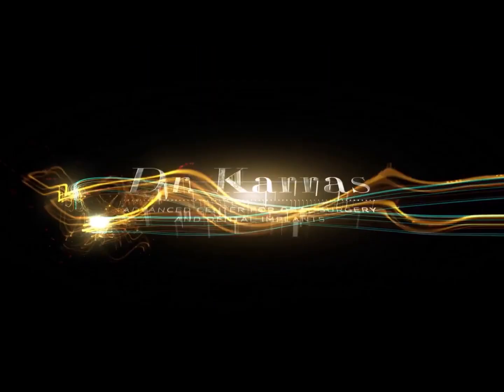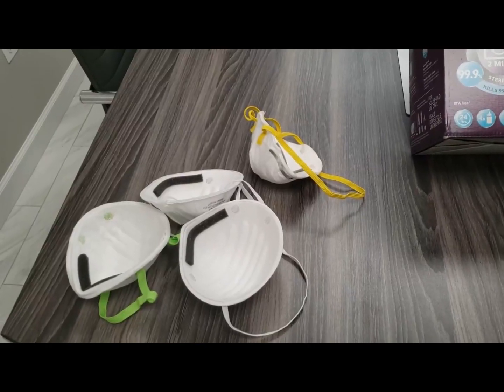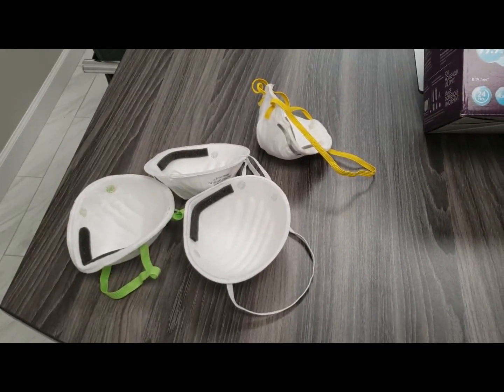Hi, this is Dr. Spiro Karras at the Advanced Center for Oral Surgery and Dental Implants, and today I'm going to show you how to sanitize your N95 masks using microwave steam. What we are going to need is, of course, our N95 masks.